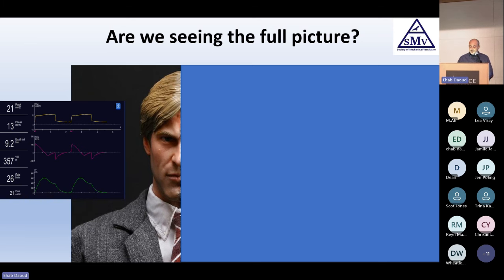Now let's look at that bad side of that other patient. And we'll talk about everything in detail. If you look at his EIT to the right, electrical impedance tomography on the right top, you would find that his right lung is so over-distended despite low tidal volume, and his left lung is almost collapsed. Let's look at the bottom, the esophageal balloon, and you will find that his end expiratory transpulmonary pressure, again, we'll talk about this, the yellow line, is in the negative. Then if you look at his volumetric capnometry, you will notice that he has a very big dead space.